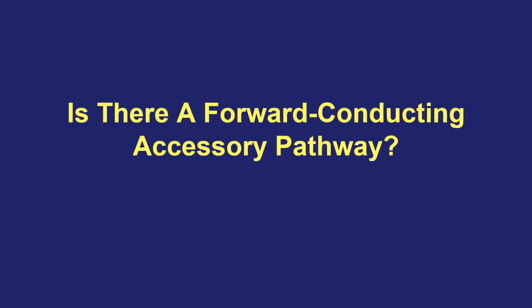So let's start by asking question number 1, which is whether or not there is a forward conducting accessory pathway present.